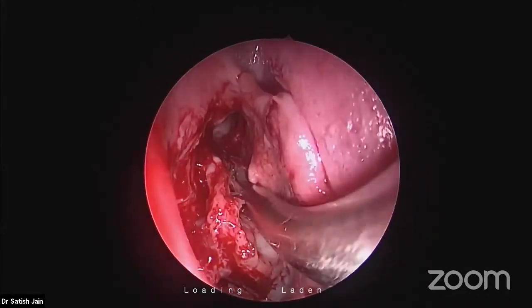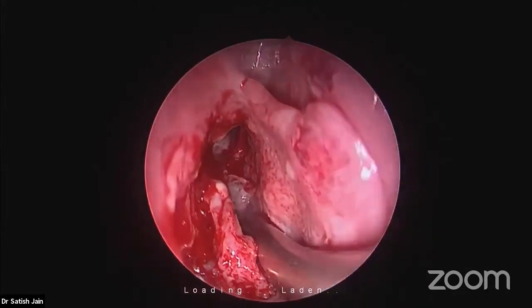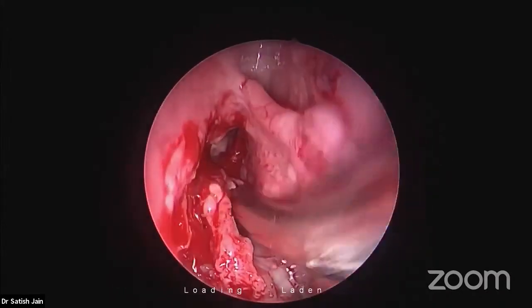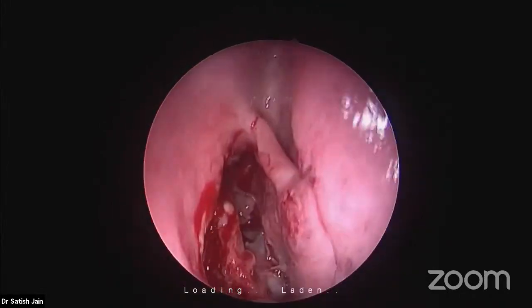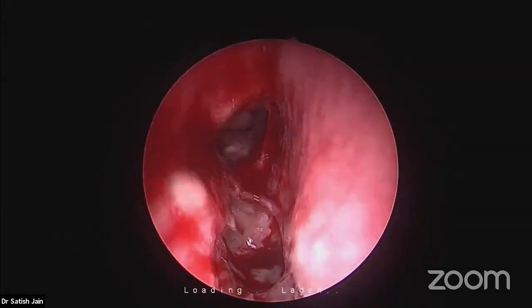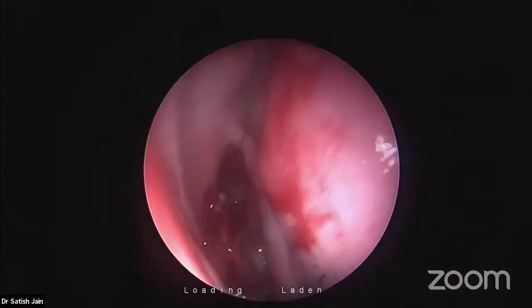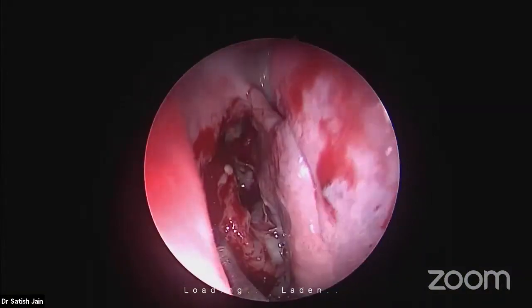When this bulla is not ascending to the skull base, that area is occupied by a cell. Can you see the artery behind? I just fractured the bulla to show how the bulla protects the artery. See the artery there. So what I did, just to show you, is why I approached the frontal sinus first before removal of the bulla.